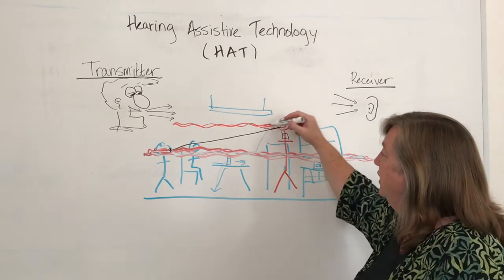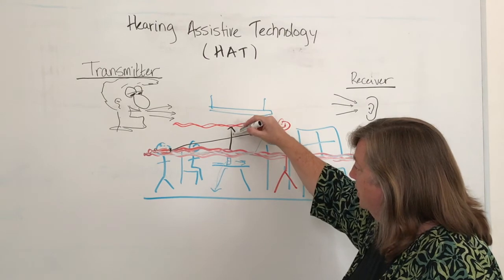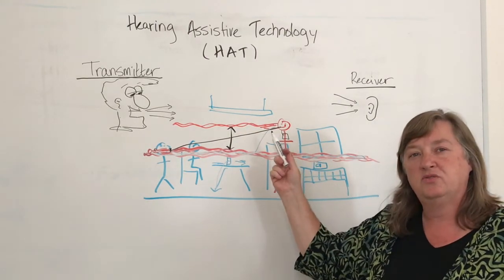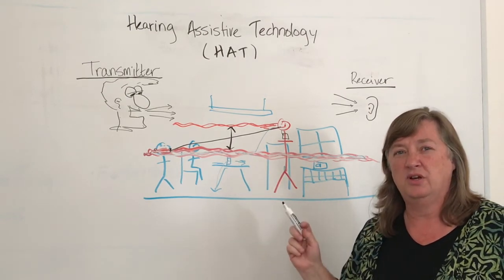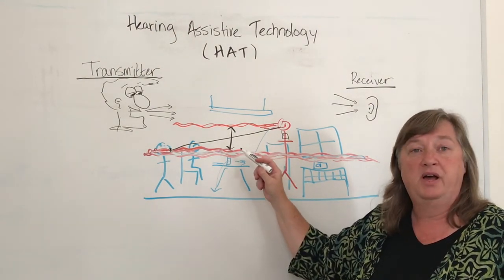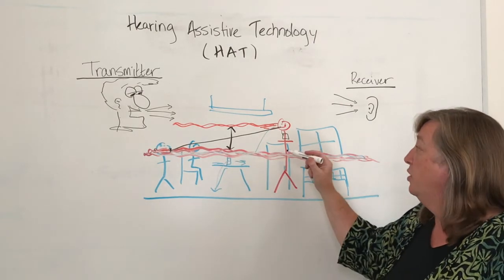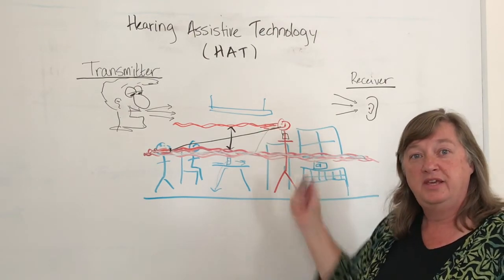That way, there is this gap, and this is really important because when you're in that crowded restaurant, if that voice that you're paying attention to was just louder, then you would be able to hear that voice above all the other background information, right? So we want to create that gap here for you.